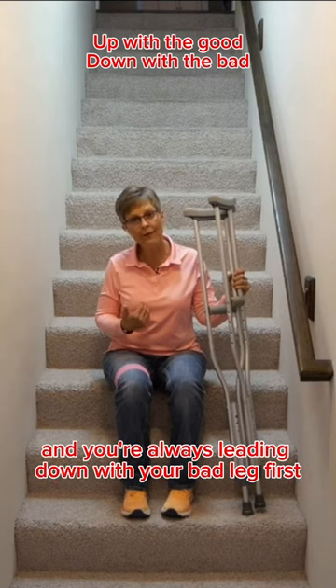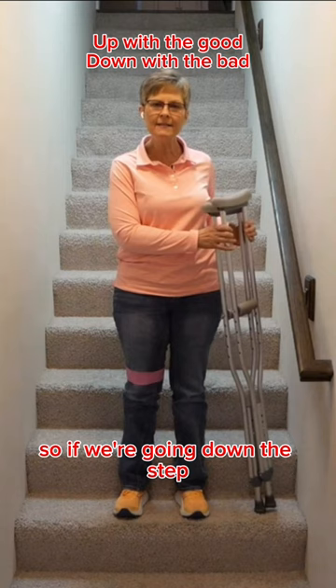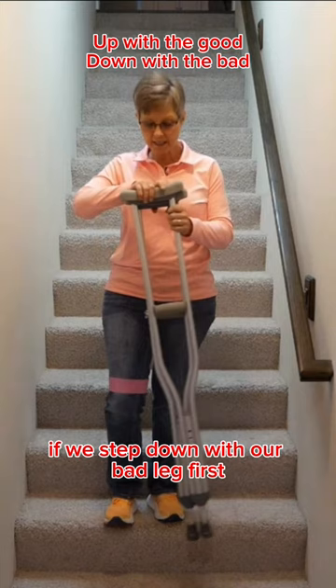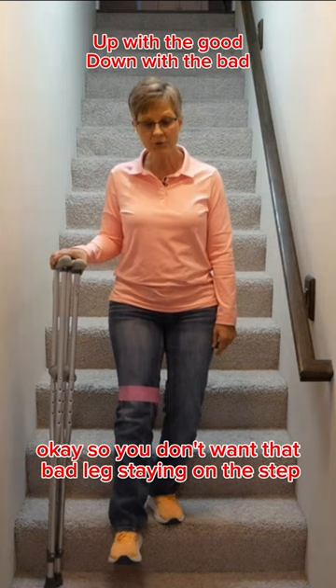You're always leading down with your bad leg first, and people sometimes say they can't go down the step with their bad leg. Let me show you why we do that. If we step down with our bad leg first, you can see that for just a few seconds I've got to have all my weight on my good leg.